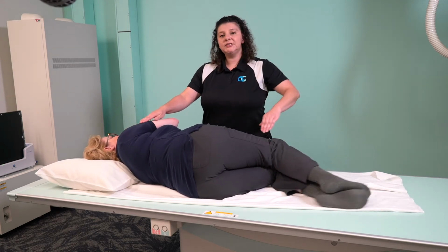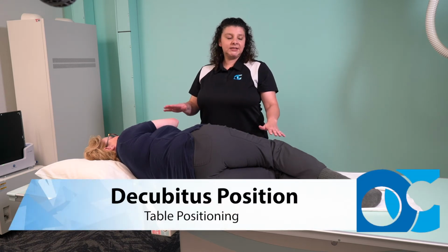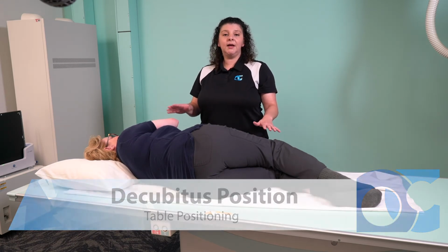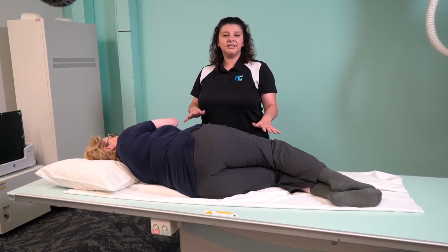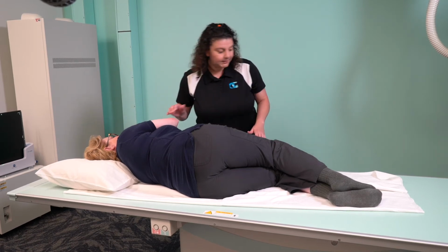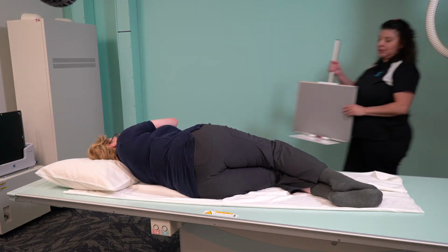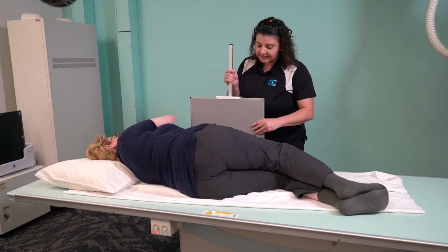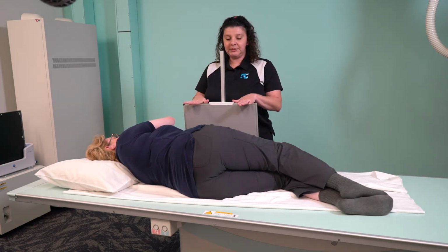Now we're going to cover a decubitus position. A decubitus position is when your patient is laying in a recumbent position. She could be laying on her back, on her side, on her stomach, but our central ray is going to be horizontal, and perpendicular to the image receptor.